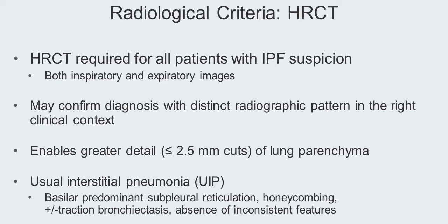By way of example, an appropriate clinical situation might be a 78-year-old Caucasian male former smoker who doesn't have any other exposures, who has crackles at his bases and has a possible UIP pattern. If you put that constellation of the clinical together with the radiographic, that might be enough to attain a diagnosis of IPF without necessarily going on to a surgical lung biopsy.